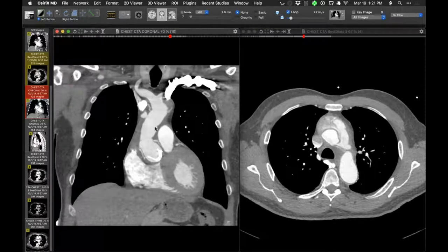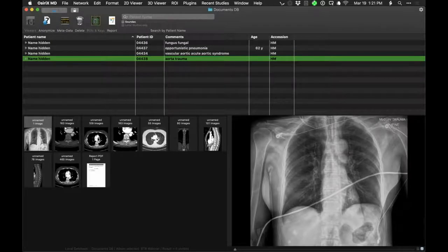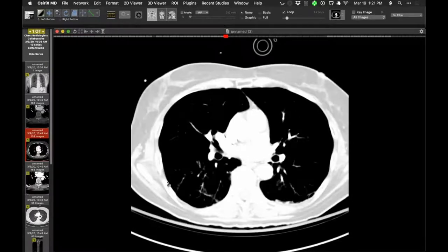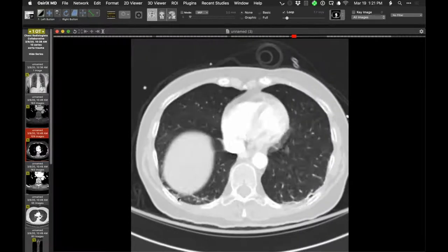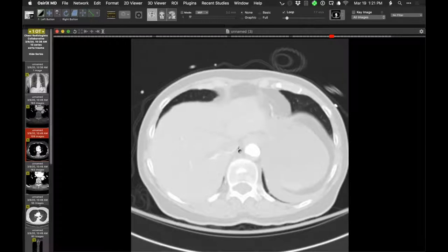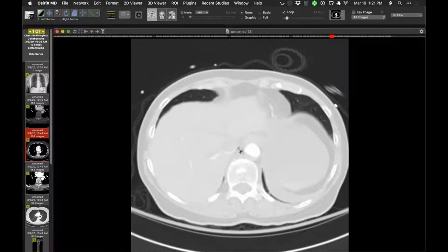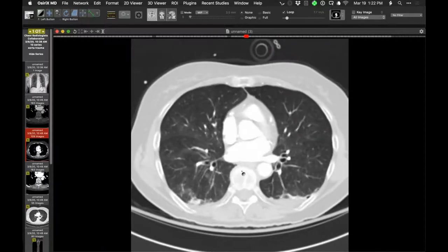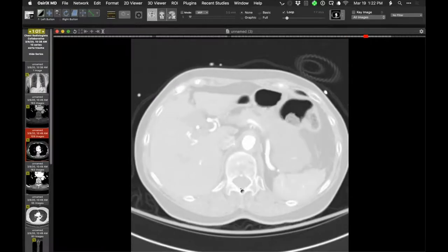Guys, could I ask a question about Howard's previous case with the lower thoracic aortic IMH, the local IMH, the gas bubbles? Do we think that came out of bone just from some nitrogen getting out or something like that from the person being whipped around? Do we have a better explanation for those little gas bubbles that were pointed out? There's a little bit here, David, too, there. There's a little touch there. Or some sort of pneumomediastinum or something like that? Yeah, it's very tiny amounts. I'm not quite sure where the air came from, being so little.